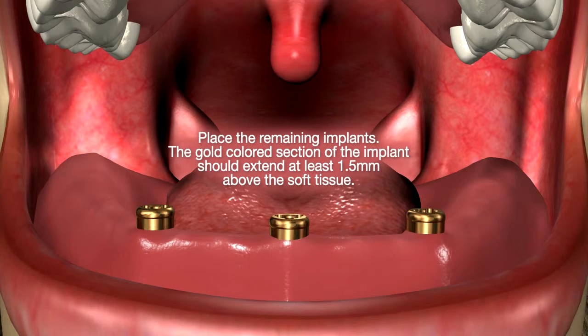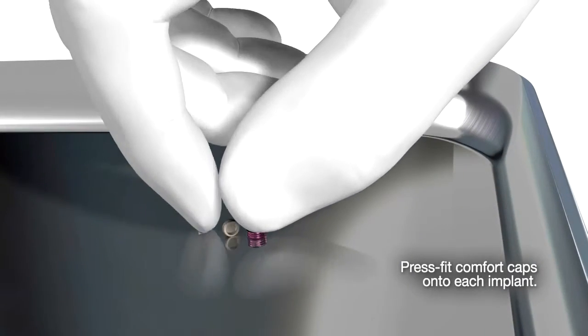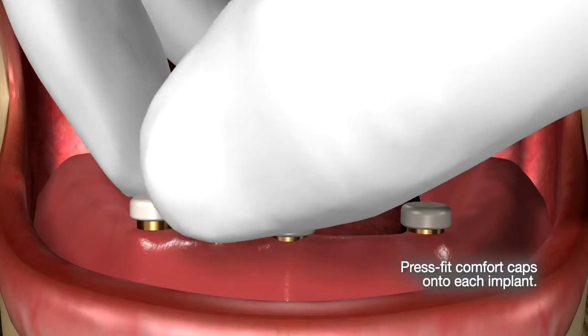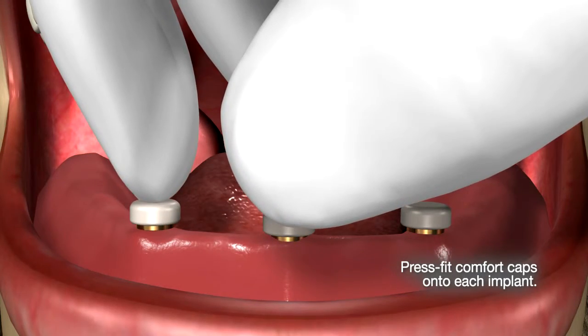There's the 3 of them. The anterior one will provide indirect retention when the denture tries to pick up in the back as the patient's chewing. Snap on the comfort caps. Deliver the patient's existing denture with a soft liner.